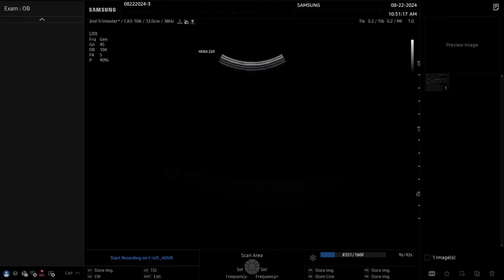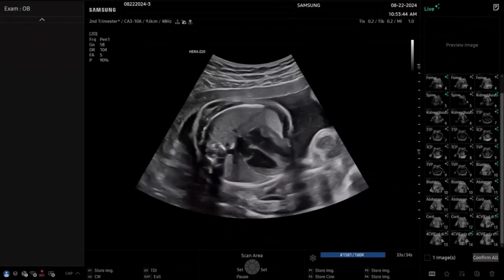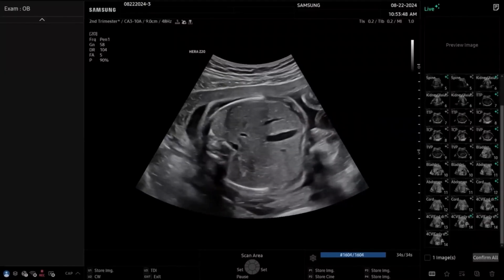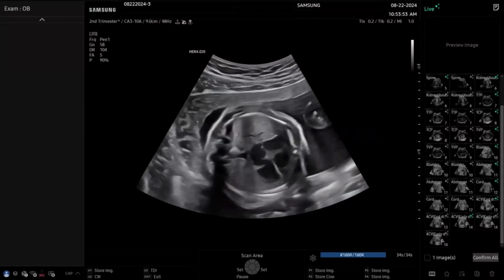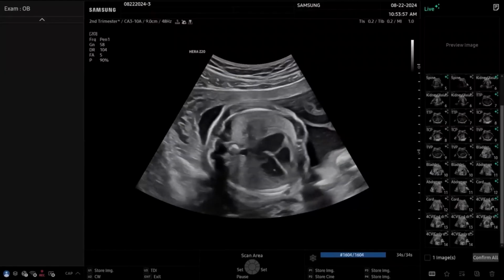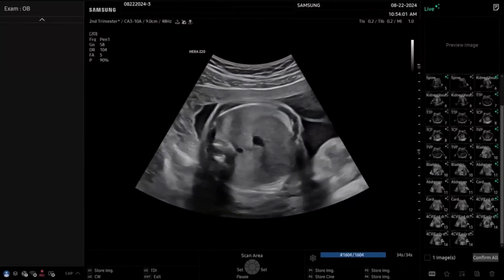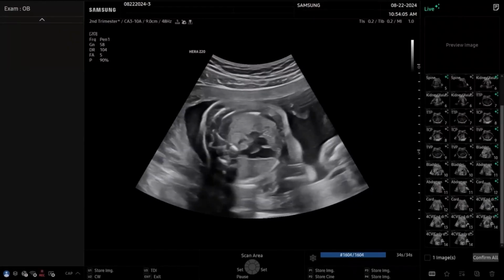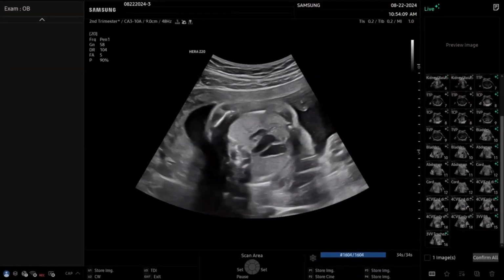And here is my personal example. This is a patient who was scanned by my first year resident. The resident was on her ultrasound rotation and had spent just 3 hours in the ultrasound unit, so basically no experience in ultrasound at all. Here you can see that we are doing the assessment of the axial planes of the fetus. We are moving from the 4-chamber view to the 3-vessel and trachea view.